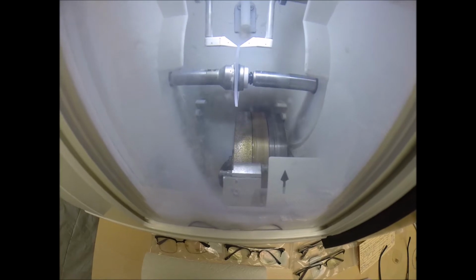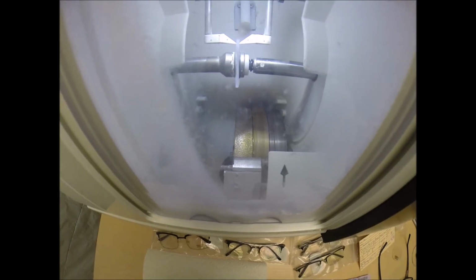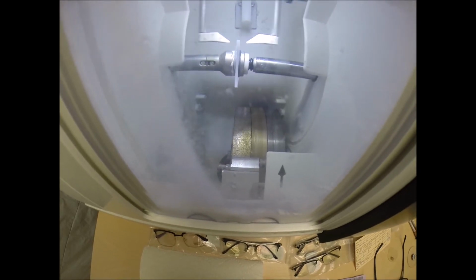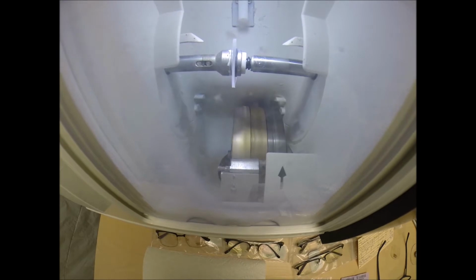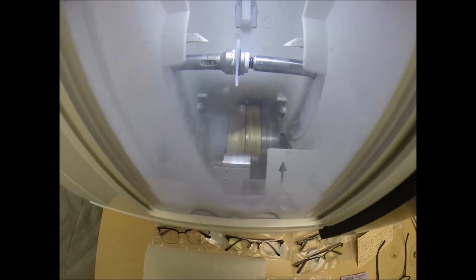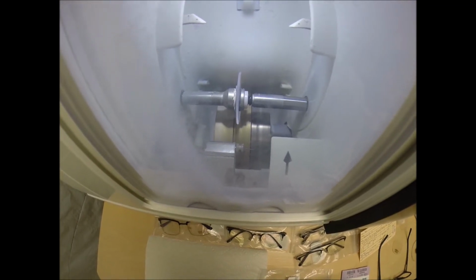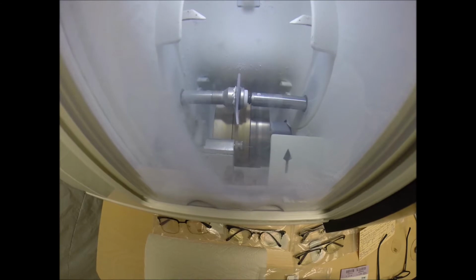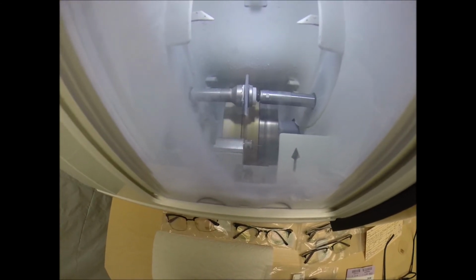Now if you notice, your lens is completely flat, just like a nickel. I could take it out of the machine now, it would stand up on its edge. But it's about to go into the bevel wheel to cut the groove into it, the knife-like edge. Very dull knife like myself, but a knife-like edge nonetheless. Your lens will be so sharp that when we're done, you might be able to cut through a piece of wet tissue, providing you soak the tissue in water overnight. Then use your lens, you might be able to cut through it.